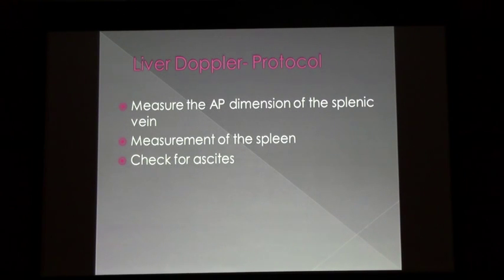What did you say about measuring the portal vein? That's one place you can do it. It can indicate portal hypertension. And 13 is the number, because I think one of the textbooks says 13 for portal vein hypertension. Your AP diameter, for the portal vein? It doesn't matter. I don't care what they say, it doesn't matter. So don't measure the portal vein.